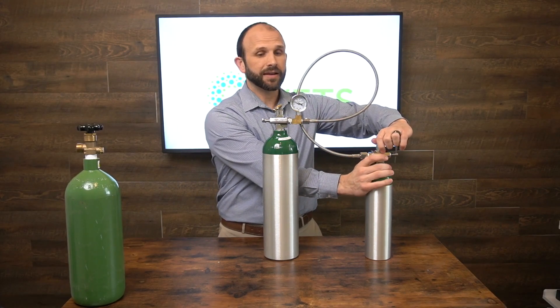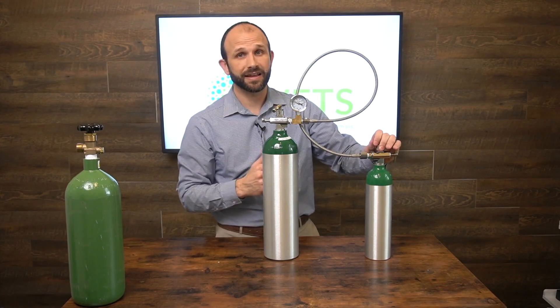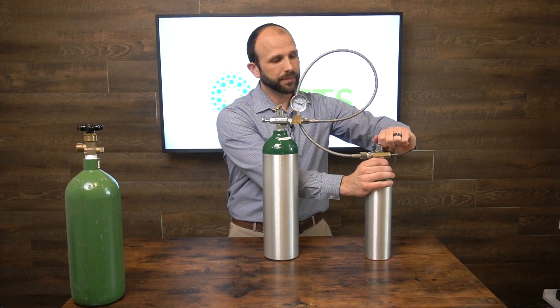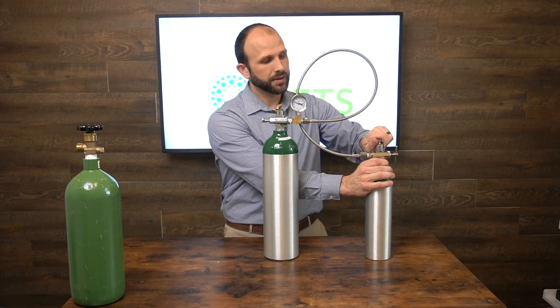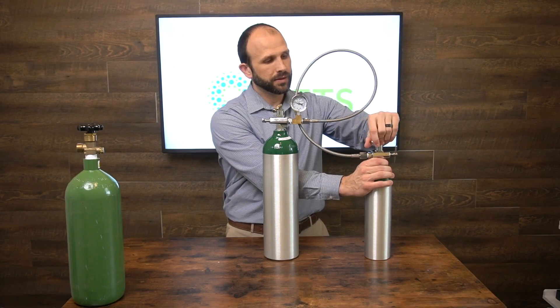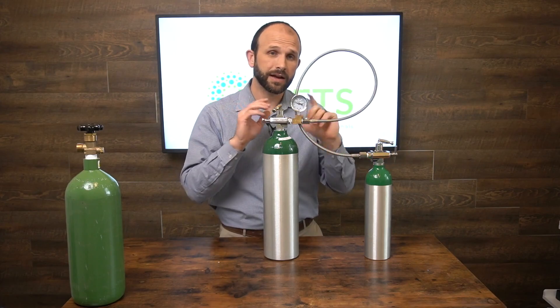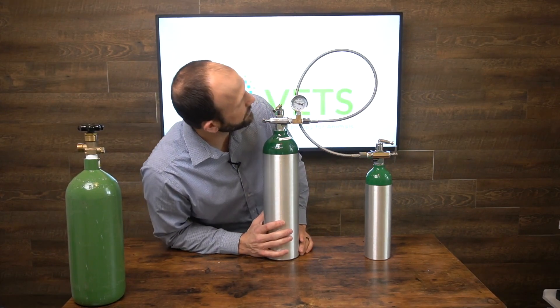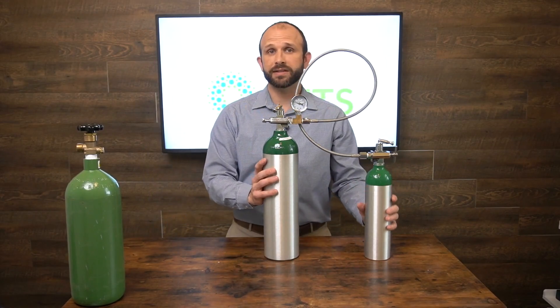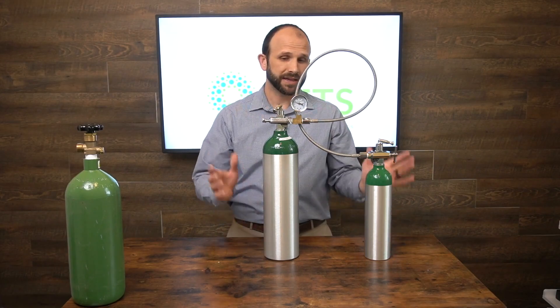If I open this tank it'll fill from the tank that's fuller to the tank that's less full. I'm just going to slowly open that. Because I didn't hear any hissing or transfer of oxygen from one tank to the next, these tanks are relatively similar in pressure — but that's how it would work.